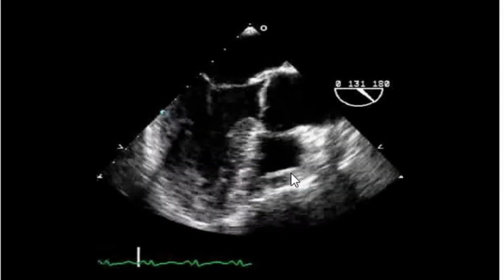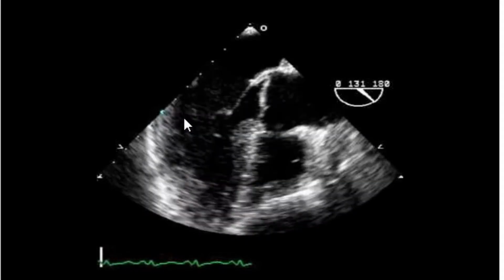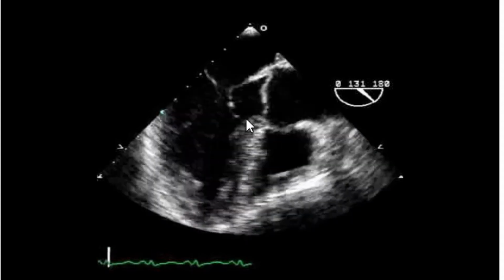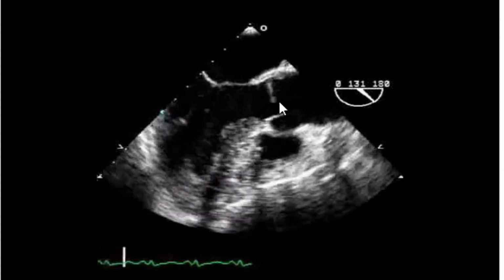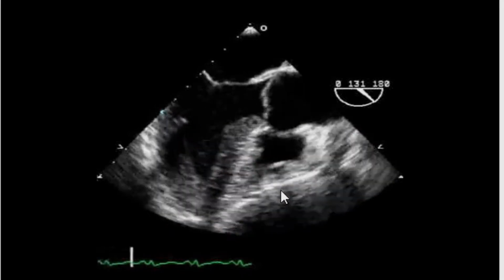And this view is used to look at mitral valve disease and regurgitations, to look at left ventricular function, regional wall motion abnormalities, to measure the size of the LV outflow tract, to look at the aortic valve function as well as any aortic valvular disease and pericardial effusion as well.